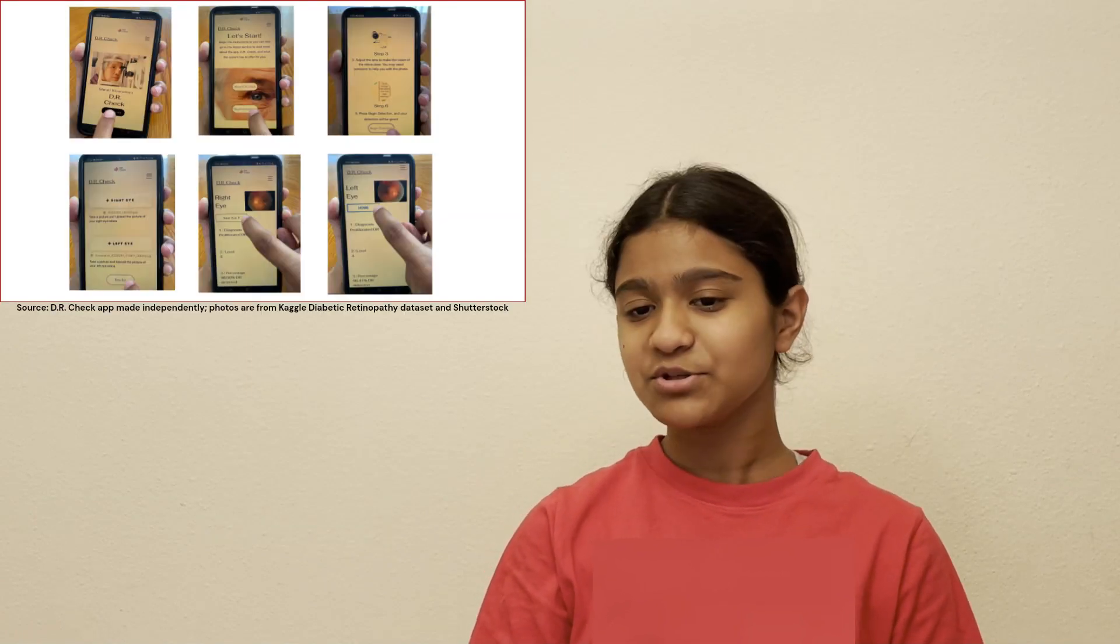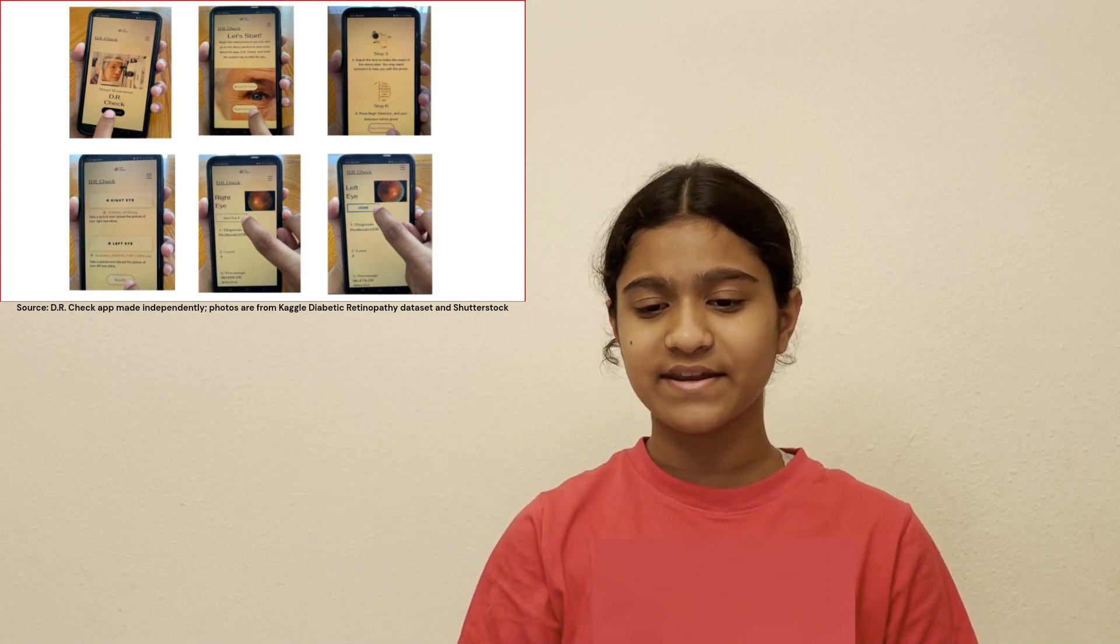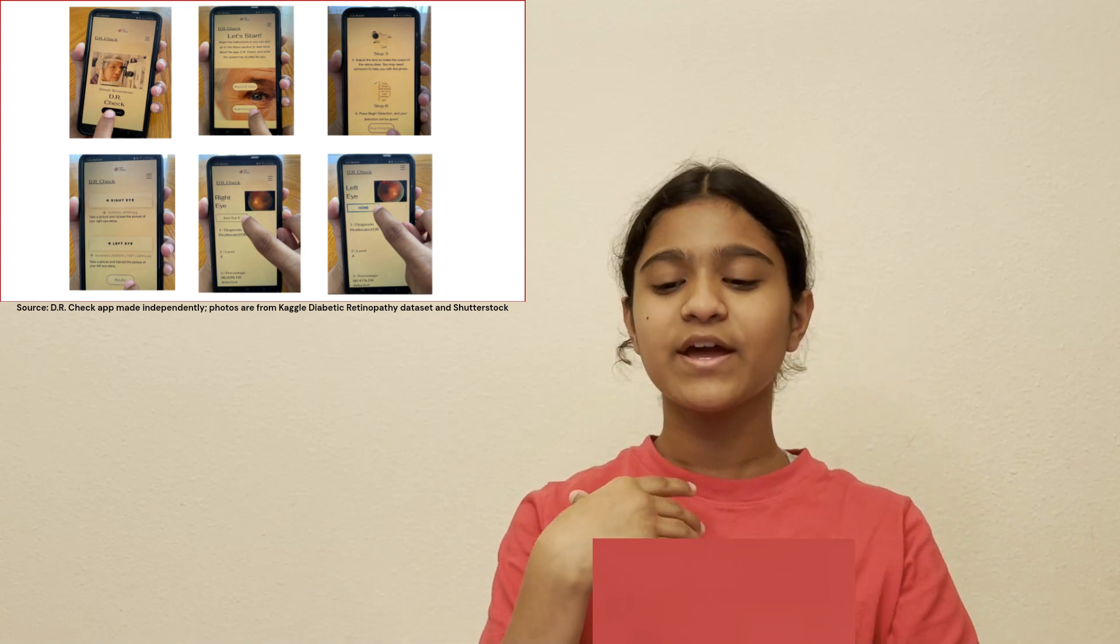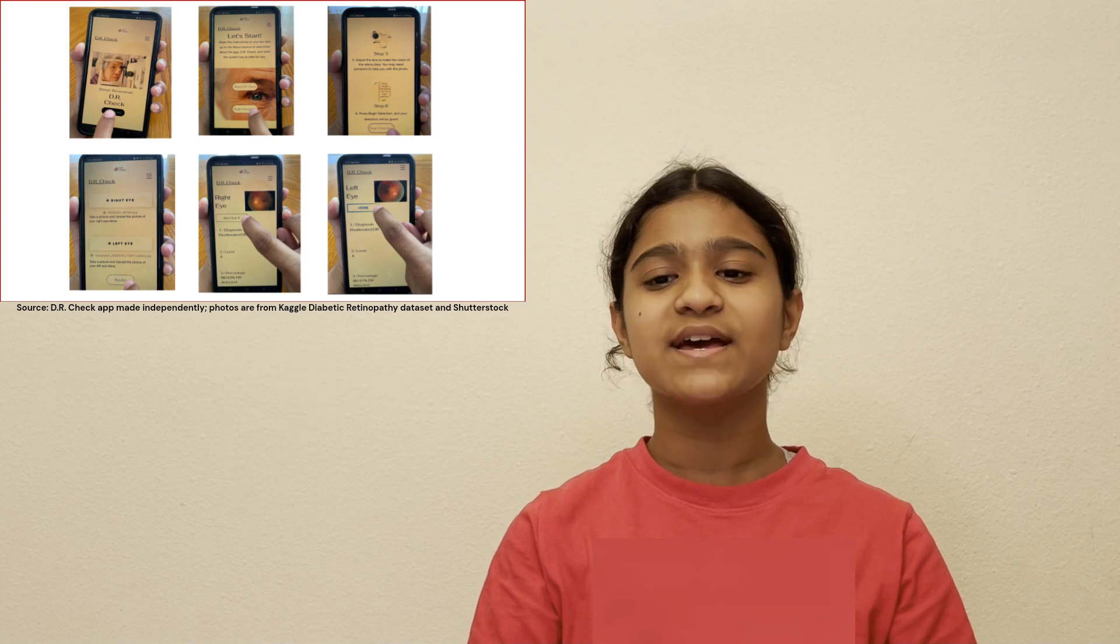Next, I implemented a front-end website that can be used either on a phone or a computer with a camera. The program requests to take an image of the eye, and this must be done using a condensing lens between the eye and the camera. The app immediately detects the eye image as having DR or not.